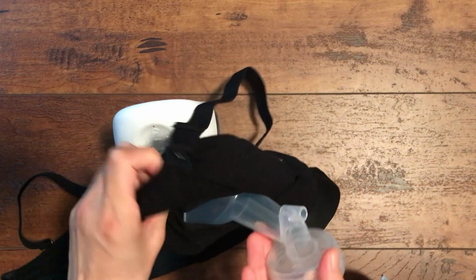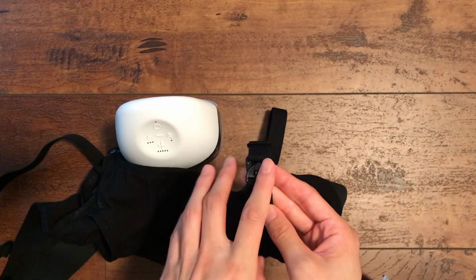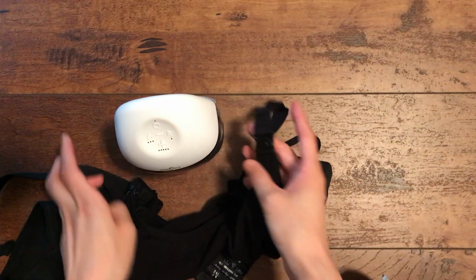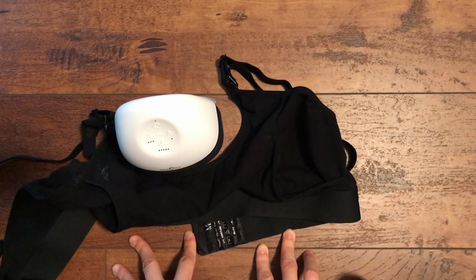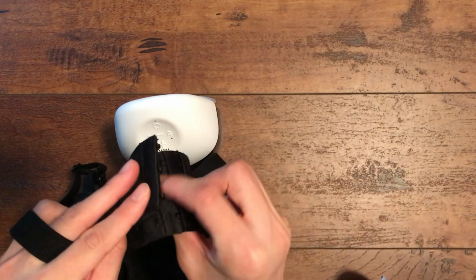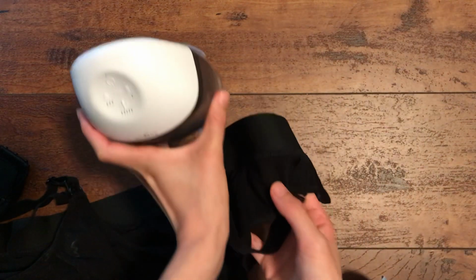So honestly, I think you can use any bra as long as this goes in there. But I like using this bra because of the hook. I think it's easy to take it out after you're done pumping if you have this hook. So that's just my personal preference. I've been experimenting with different ways to wear this pump. I think what's been working the most is if you make sure that this part around your body is tight, because when you place this in the bra, you don't want it to fall off.